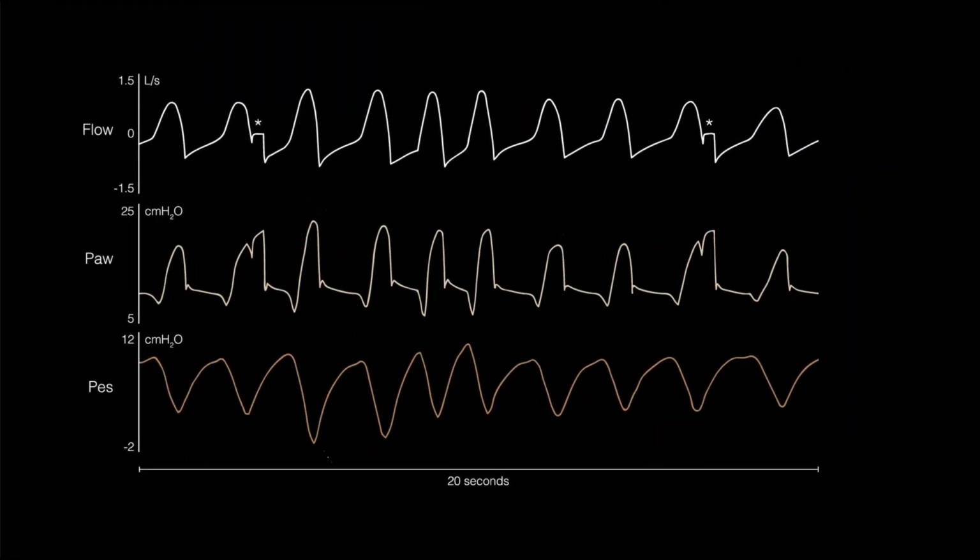This illustration shows you the inspiratory pauses that are used to calculate lung mechanics. And if you look at the lower waveforms, you can see the direct correlation between esophageal pressure and airway pressure. The level of support mirrors the magnitude of inspiratory effort.